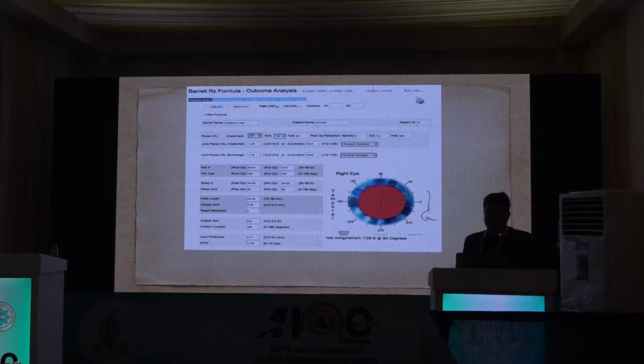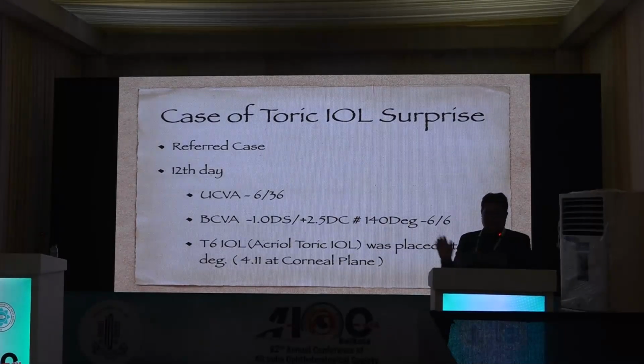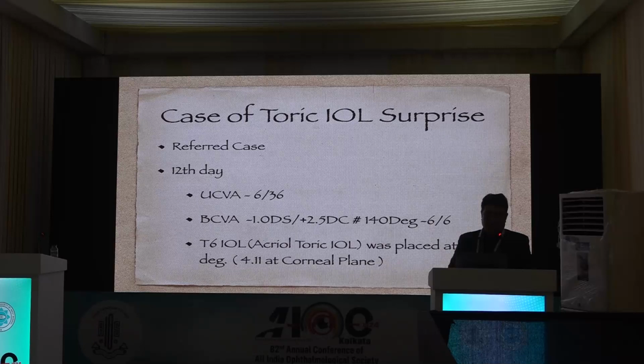Even Barrett has the Barrett Rx formula, which can tell you whether you need to rotate the IOL, put a piggyback IOL, or exchange the IOL. I'll just share one case here to make it very easy for you to understand.